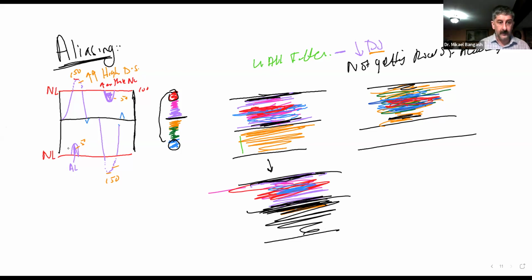If we apply the wall filter, the top blood vessel may see a little removal of those lower velocities by the vessel wall, but the rest remains as if nothing has happened.